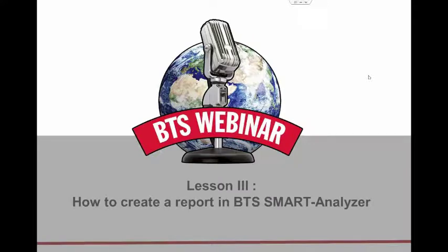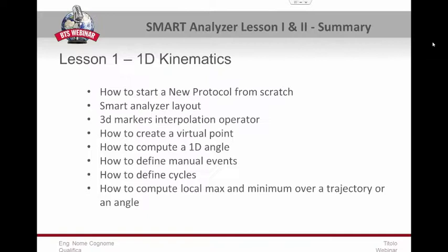Good morning to everybody. Now we are going to start with the third and final theoretical lesson over the BTS Smart Analyzer application, where we will finalize our analysis protocol into a complete report. Before starting, just a quick summary about what we have learned during the previous two lessons.